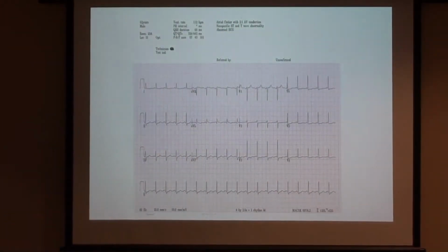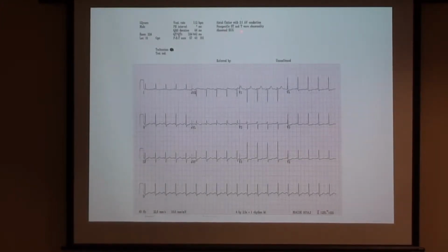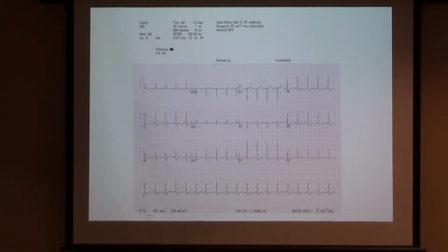We're covering that up because, as you can see, this is incorrect. And it's typically incorrect. It's very commonly incorrect. The only time it's ever right is when it says normal. Pretty rare. Remember that this little first deflection is a one.